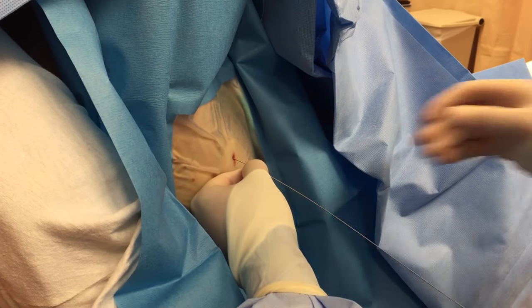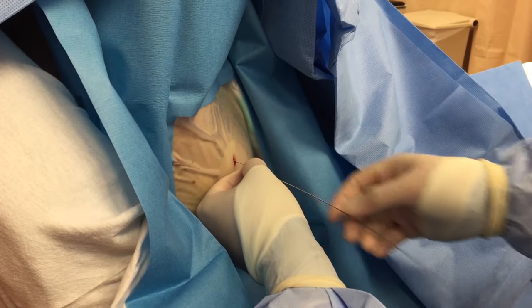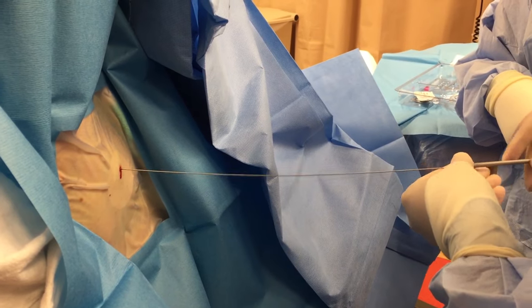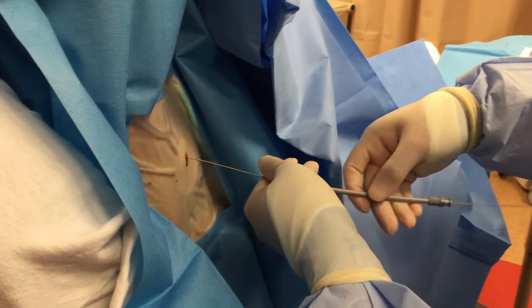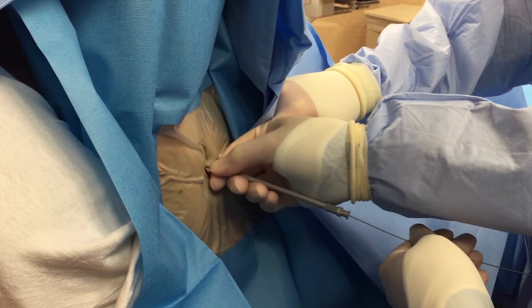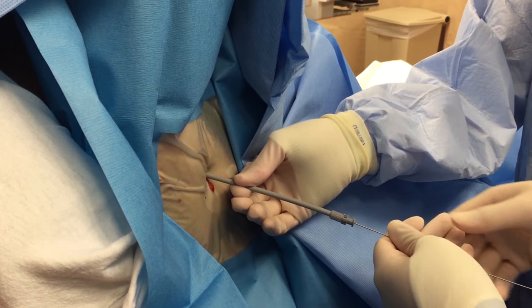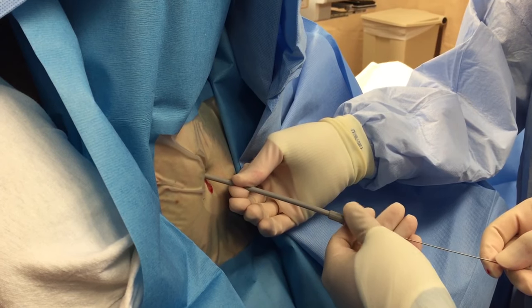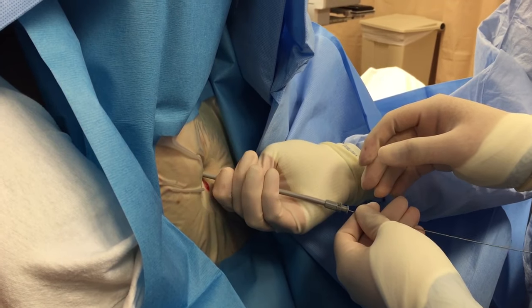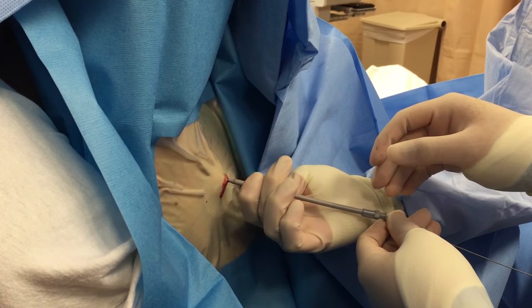Always make sure your wire moves around within the cut you just made. Now here's the move. You first put it on. You're going to get to a point where you reach a little bit of resistance. What you do when you reach that resistance is you push against it, and then you twist. You're kind of trying to grab all the fascia. On to the dilator. And then when you get enough twisted, you pull back to rip that. Then you go in and do it again.